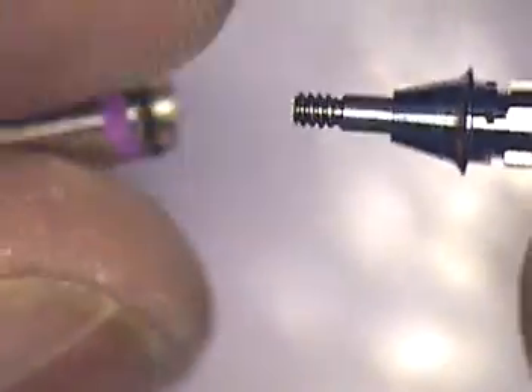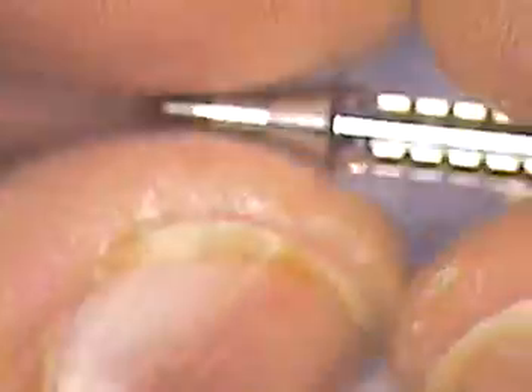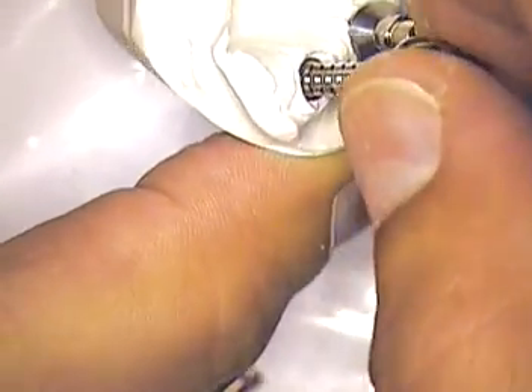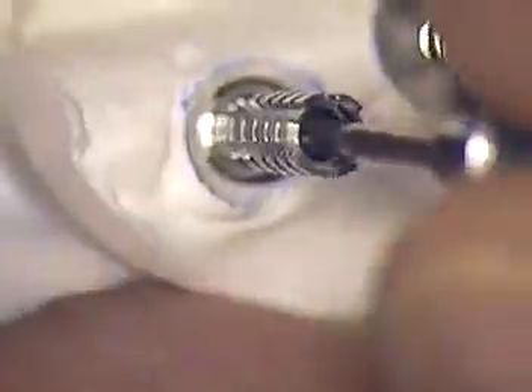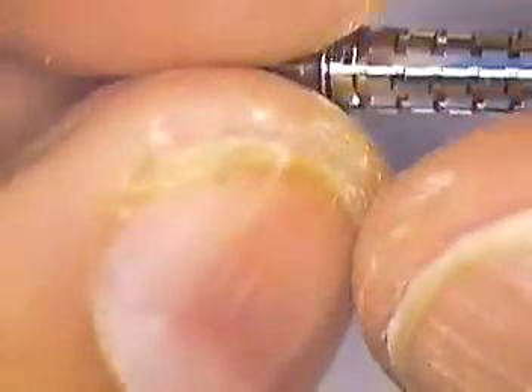What I found, and what my lab has found, is that the flared metal skirt gets in the way and you have to trim it away. Let me show you first how it gets in the way. If I go to seat this in here and start tightening it down, what happens is it's not seating all the way. When we took our impression earlier, I showed you that we made a nice V-shaped funnel impression, copied right off the peak abutments. But unfortunately, now we're at a standstill — we can't build to this until we treat the metal of this temporary abutment.